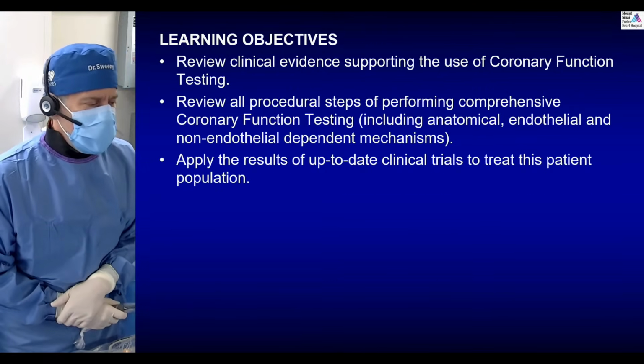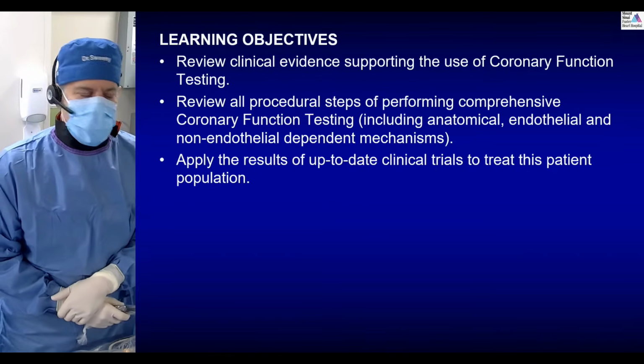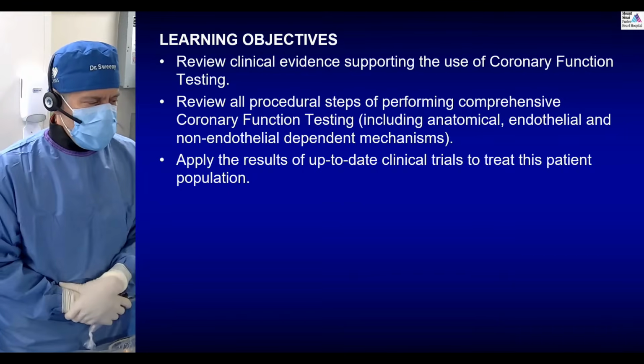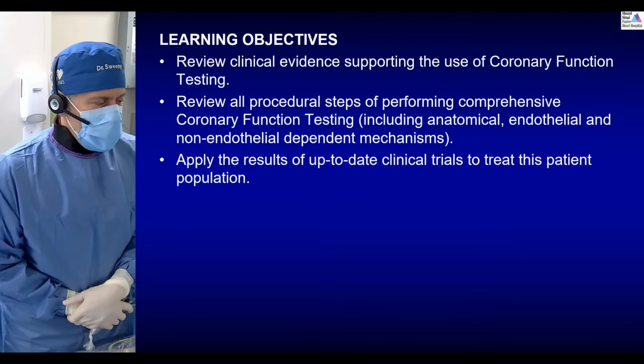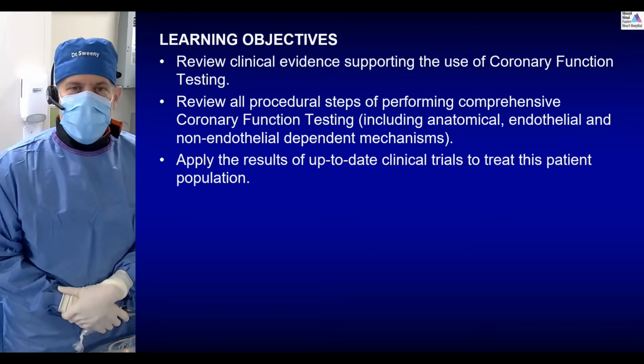The learning objectives today are to review some of the clinical evidence supporting the use of coronary function testing, review all the procedural aspects step by step, including the anatomical, endothelial, and non-endothelial mechanisms at play, and then apply the results of up-to-date clinical trials to treat this patient population.